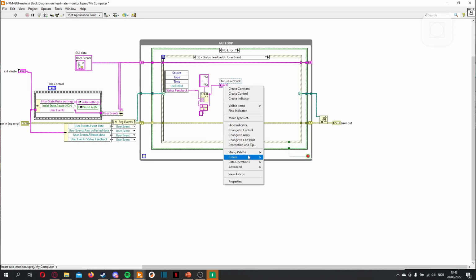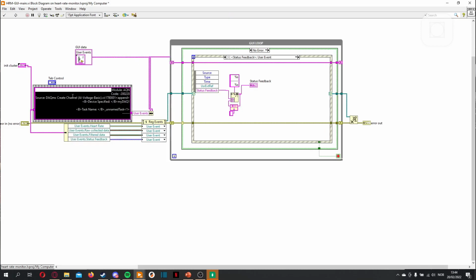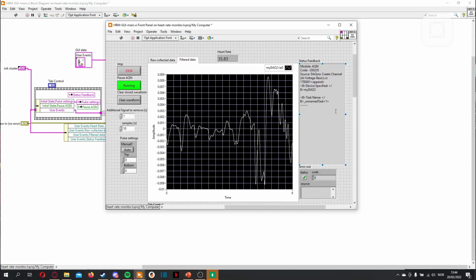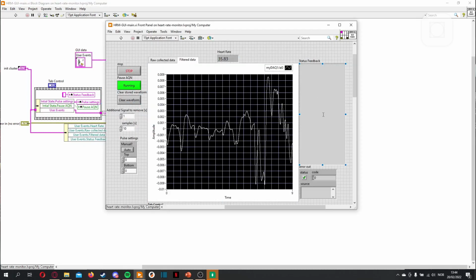Create a local variable. Then just here in the beginning, we'll put in empty data. Then we'll create a constant. But as you see, the constant copies all the data in the control, which can be useful if you're trying to copy some data of some sort. But let's now delete it before we do this, because that's not what we want. There you have it. We have this bigger and this is cleared.